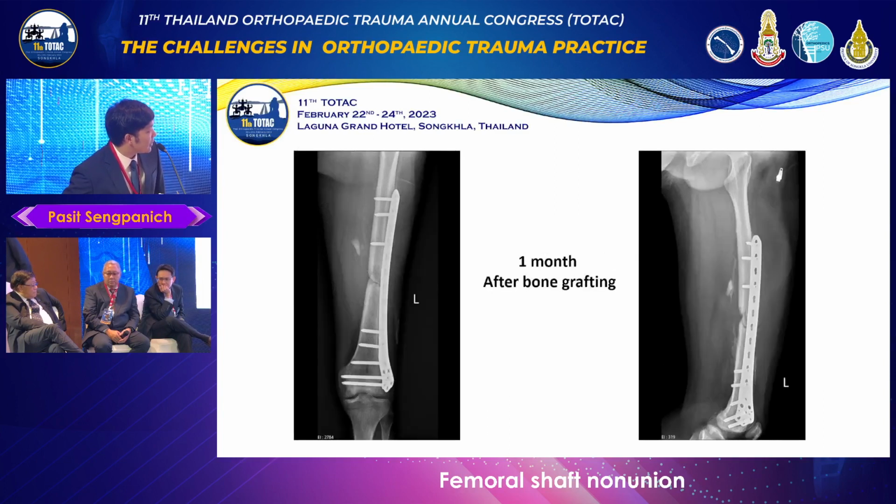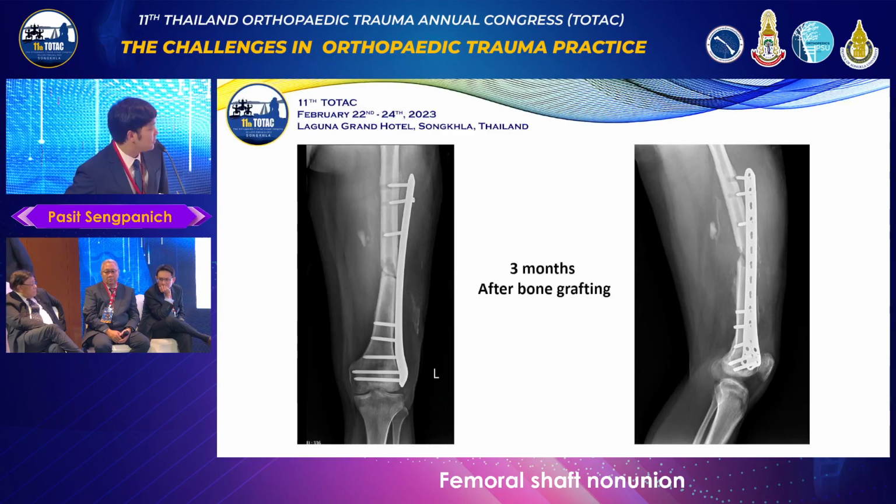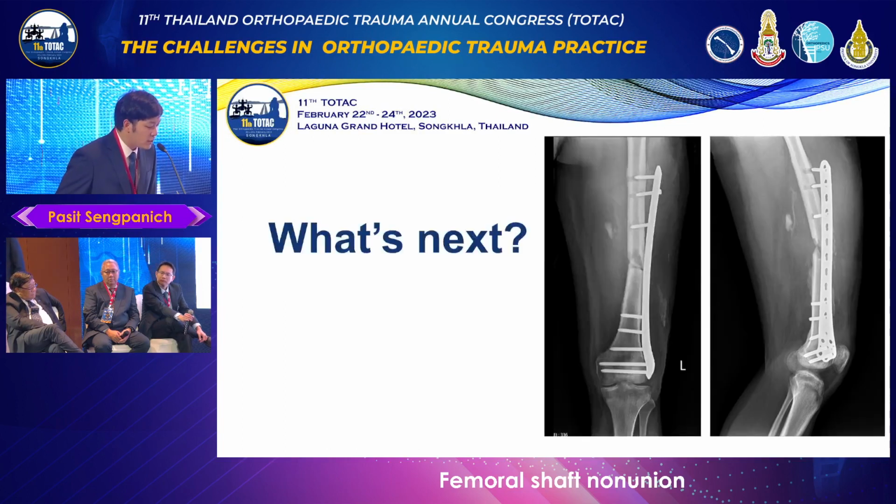This is a film at 1 month after bone grafting. And as we can see, 3 months after bone grafting, we look at the fracture, still no callus, and the plate pulled out from the bone. For that event, may I ask the panelists what they recommend for the first treatment, and what are your plans?